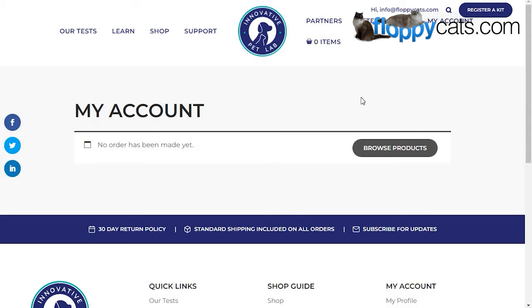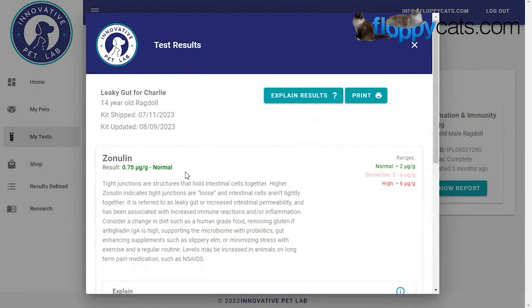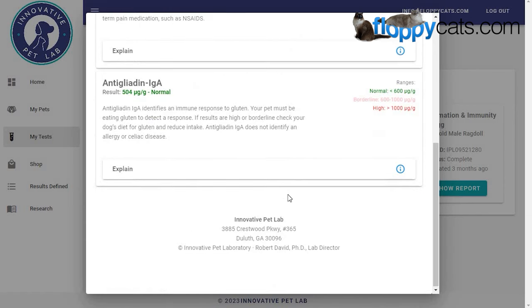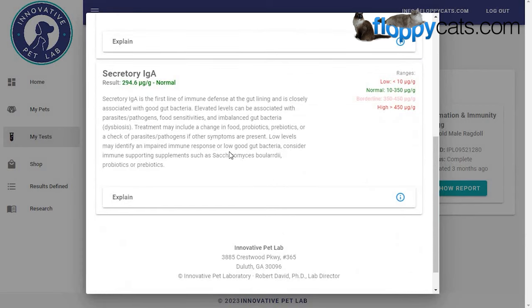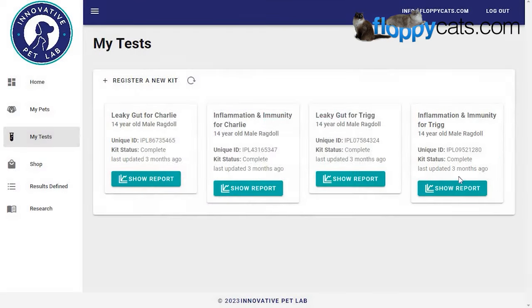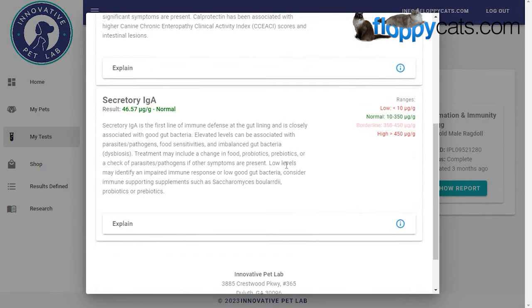Our results are in from Innovative Pet Labs. Once you've logged into your account, go to 'My Results' and it opens up all the reports. We did leaky gut and inflammation and immunity for both Charlie and Trigg. You click 'Show Report' and you'll see that Charlie's leaky gut was normal, his IGA was also normal, and everything was normal for the inflammation and immunity test. Leaky gut for Trigg was also all normal, and his inflammation and immunity was all normal as well — which is great.